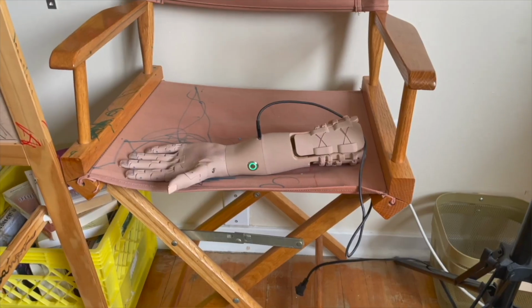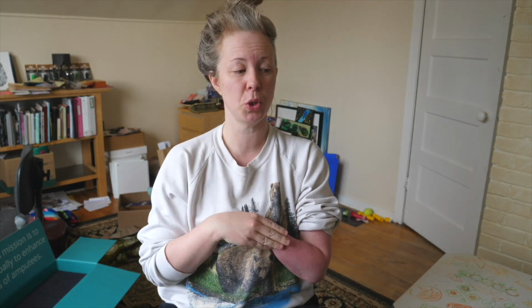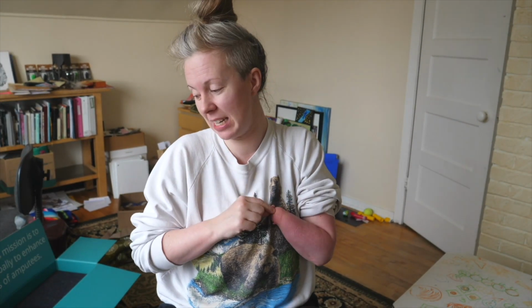My arm is charging. I'll film it right now for you so you can see it. There she is. Pulsing green to charge. It takes 4 to 6 hours to charge. Now, the impatient part of me wants to unplug it right now and just see what happens. But I don't know if that's a good idea. So I'm gonna try to use up some time while it's charging, see if I can get at least 10 more minutes of charging in.